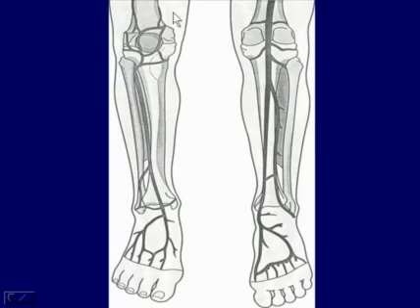In terms of the tibial level vessels, if we look from an anterior approach, as this limb here to the left of the screen shows, we can see the anterior tib coming out through the interosseous membrane, coursing along the lateral edge of the tibia, continuing down the limb, crossing the ankle joint, and at this point it's called the dorsalis pedis artery. So we'll try to evaluate this entire length of this segment.